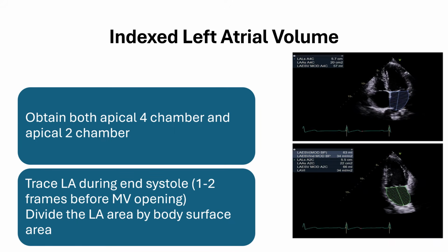Again, not every point-of-care ultrasound will have the software to measure the left atrial volume. Another thing to remember is that left atrial volume can be increased not only in patients who have diastolic dysfunction, but also in patients who have mitral valve pathology, such as significant mitral regurgitation or mitral stenosis, which is something to keep in mind.